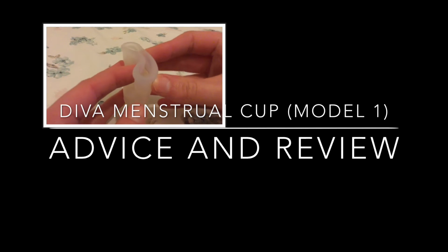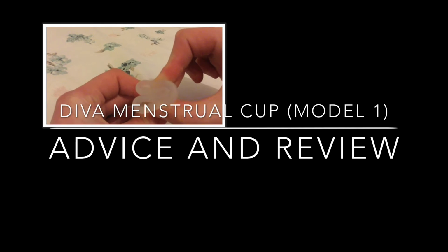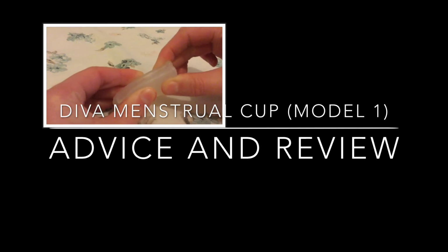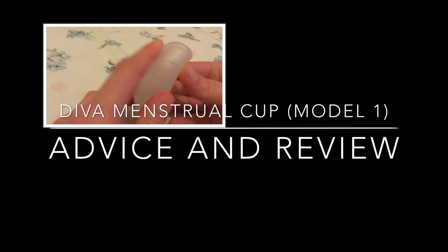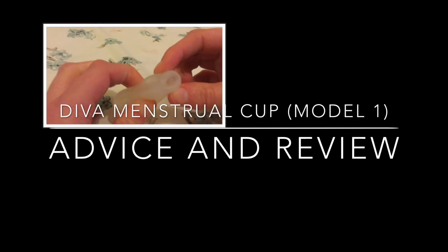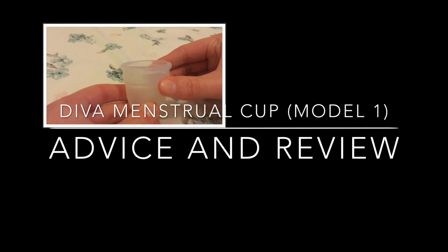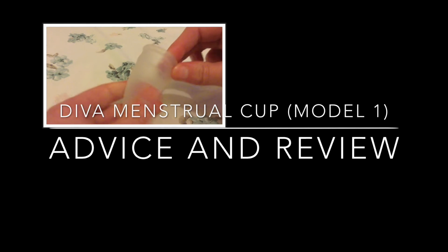For those that don't know, there's usually 2 main types of folds that you can use when inserting your menstrual cup. The first one being this type of fold, which is typically named the U fold. I actually personally prefer this fold as I find it much easier for the cup to unfold when it's actually inside. Then there is this fold, which I did try but it just didn't work for me, and that is what it looks like right there. To be quite honest, I always forget the name for this one, so I personally just call it the taco fold because to me it looks like a little taco. So don't ask, but that's my thought process apparently.